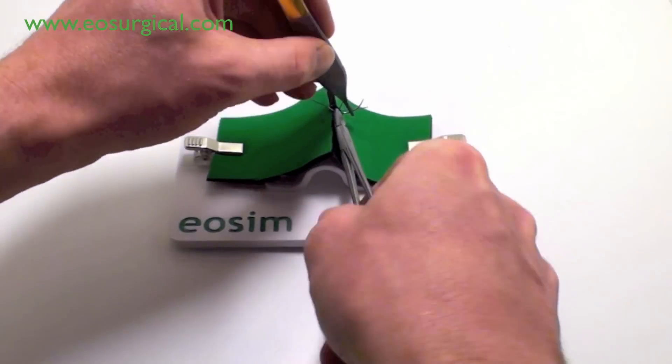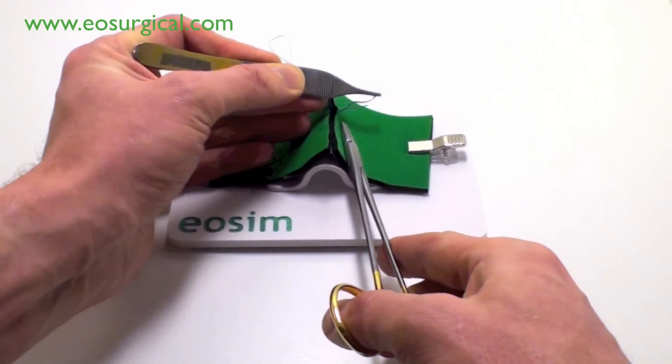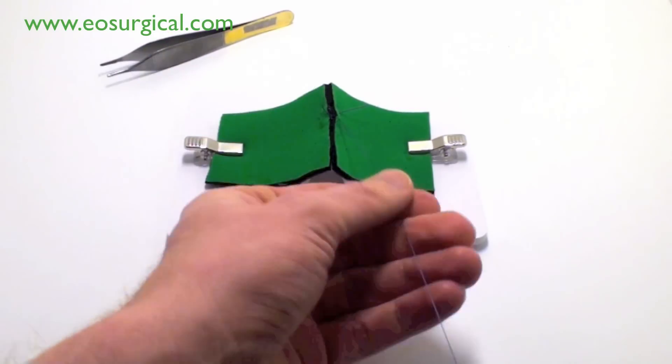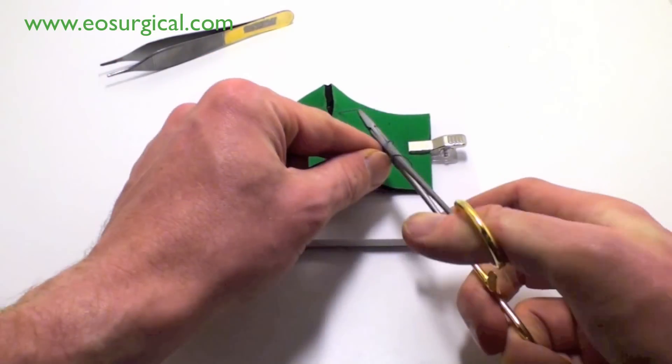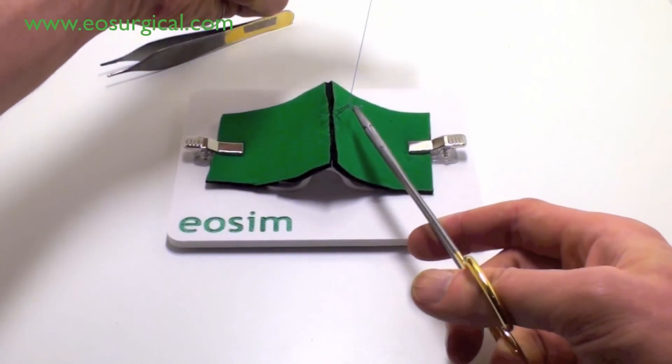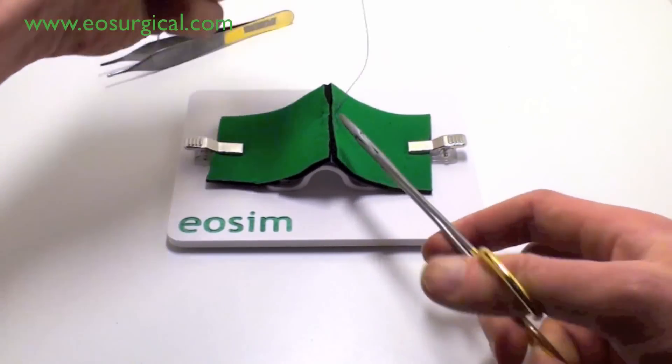Note how the hand is going to try to keep the suture from being entangled while placing it in an ergonomic position. At this point, you can tie the surgical knot.